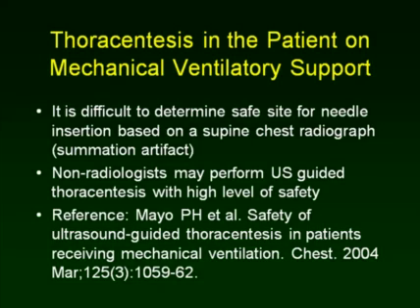It becomes very important then for the intensivist to develop a good skill level in identifying a safe site in this patient population. This article will reassure you that ultrasound guidance of thoracentesis can be performed with great safety in this challenging patient population by non-radiologists.